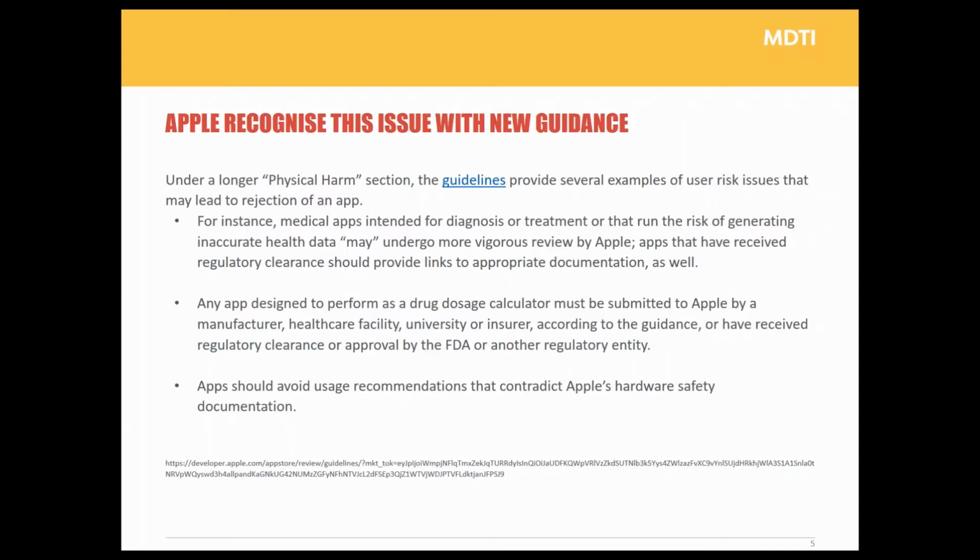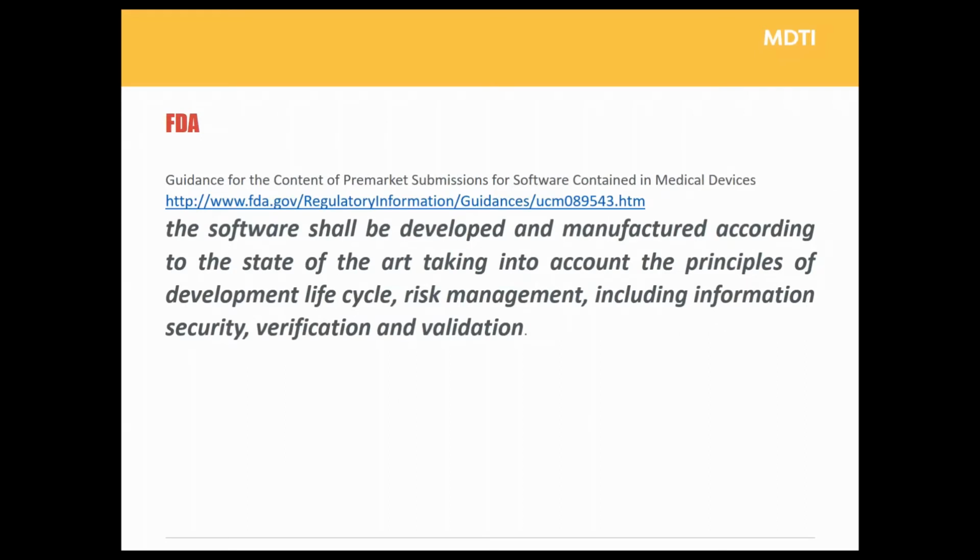The FDA are probably ahead of everybody else in really defining how to deal and work with software in medical devices, and they have a bit of guidance out there on the internet. The links are there for you. I'd highly recommend you go and look at that. It is free for use, and actually is an excellent summary of what you should be doing during the development process for medical devices. And they've had that out there for quite some time. Everybody else is sort of catching up at the moment.